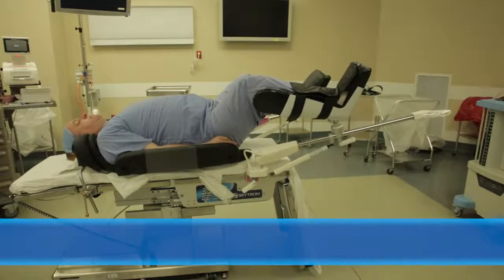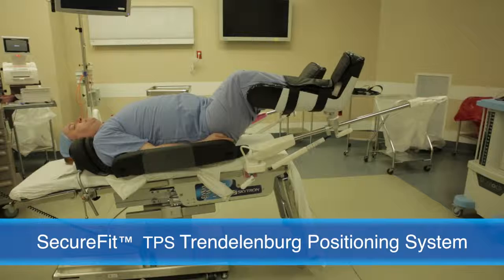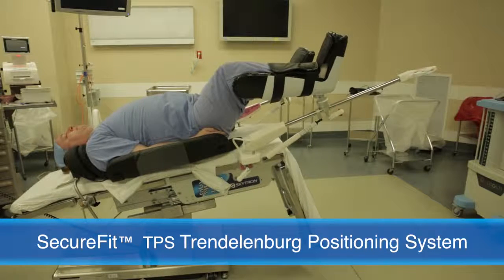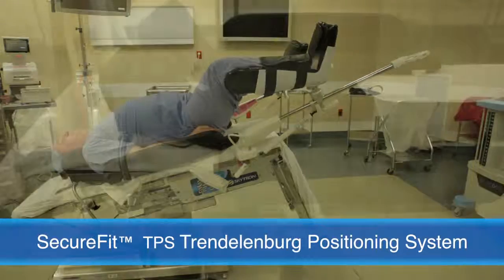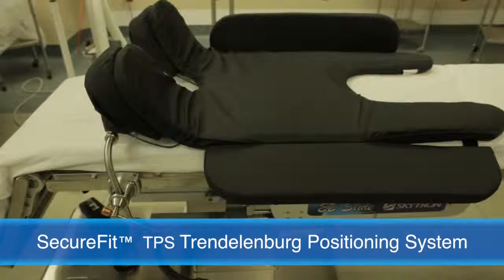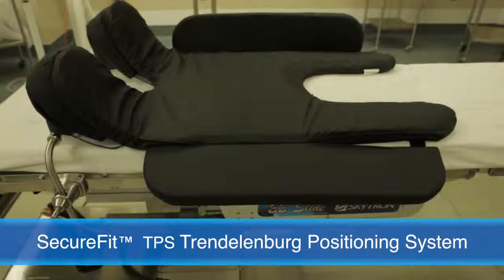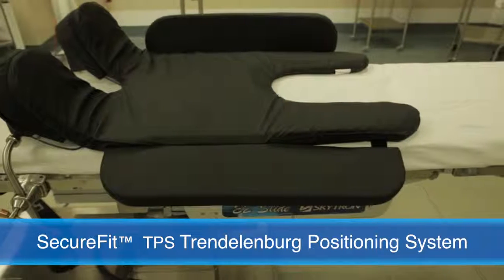The SecureFit Trendelenburg Positioning System delivers a simple, safe, and secure way to position patients for Trendelenburg procedures. The proprietary design combines a uniquely contoured surface geometry and a patient-conforming viscoelastic gel pad to resist sliding and redistribute surface pressure.